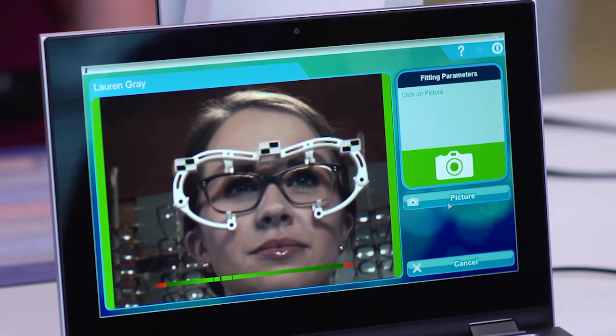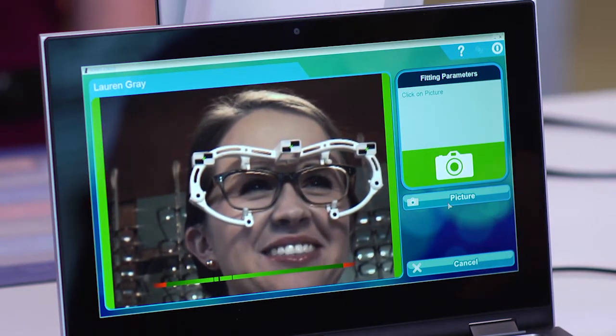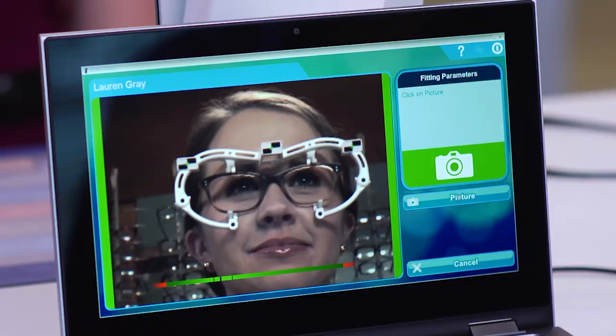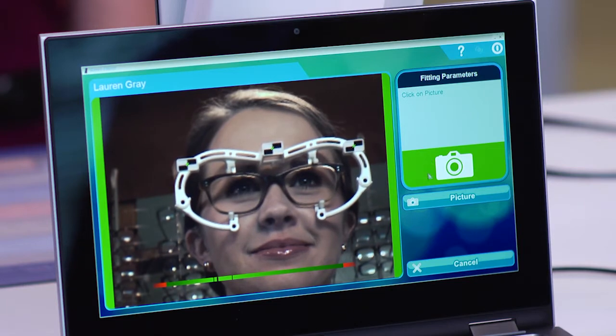If the patient seems tense, you can help her relax by asking her to look at you for a few seconds, and then once again look at a point straight ahead in the distance. Be sure to check that the sensors placed on the front of the frame clip are visible. The camera icon is displayed in red if the frame clip has not been detected, and in green once it has been detected.